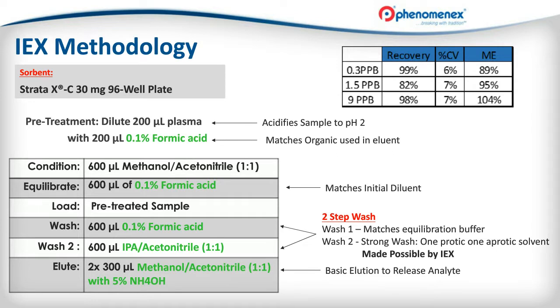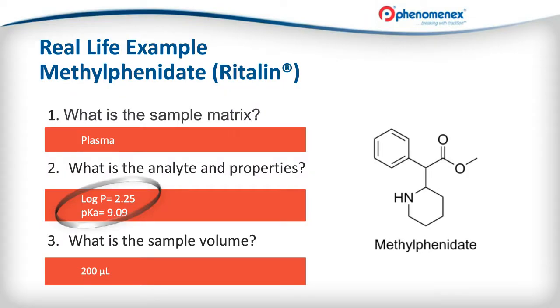So, okay, this is the last part, and this is what would happen if you didn't decide and listen and go with the ion exchange method. Because methylphenidate is hydrophobic enough, we can actually do this via reverse phase interaction, and hopefully I'll show you here that you can get there and the method might even be as good, but man, it's going to take you a lot more time.